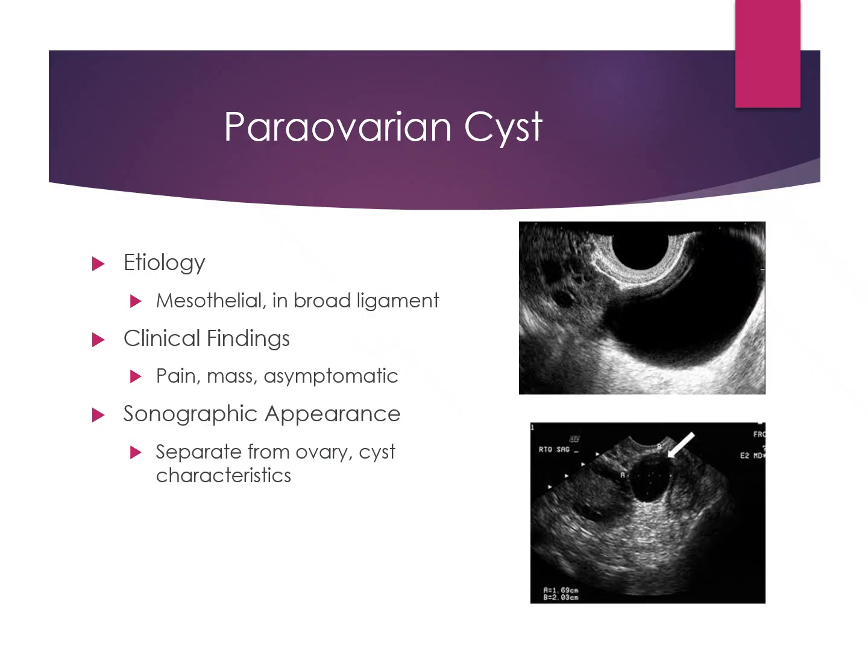When we talked about ovarian cysts, we talked about cysts within the ovary. These are actually para-ovarian, meaning around or outside of the ovary. And they're going to look exactly like a regular cyst. You might have some debris inside of it if it's hemorrhaging, but it's going to be separate from the ovary. And it's going to cause pain just like an ovarian cyst would.